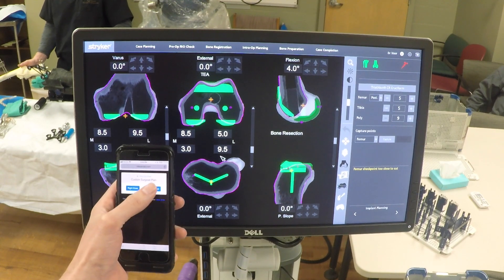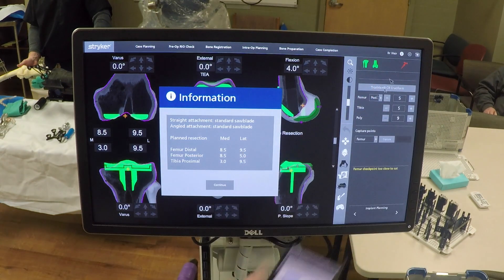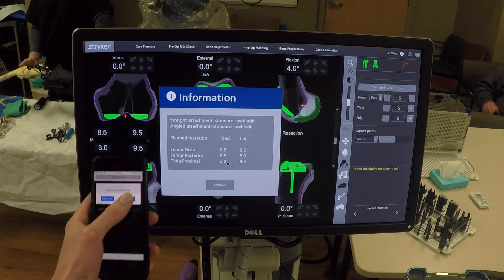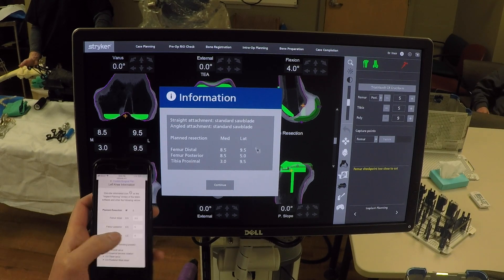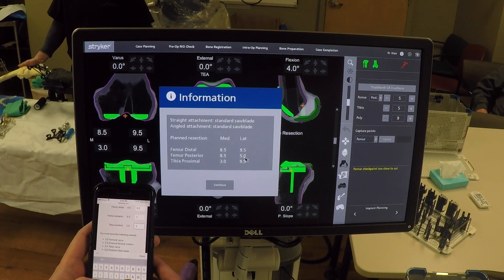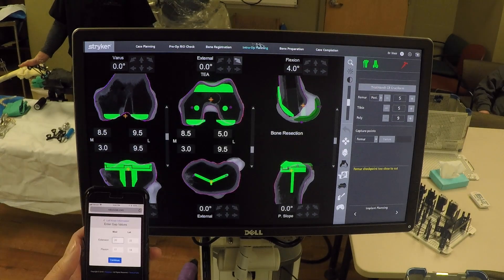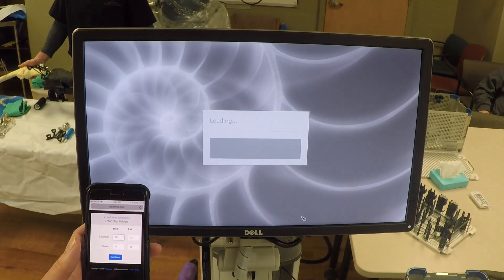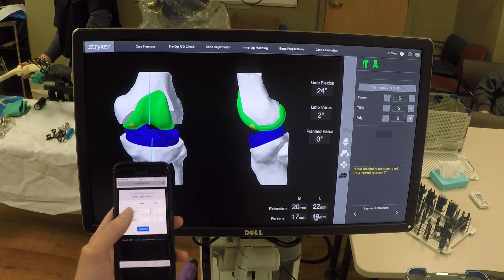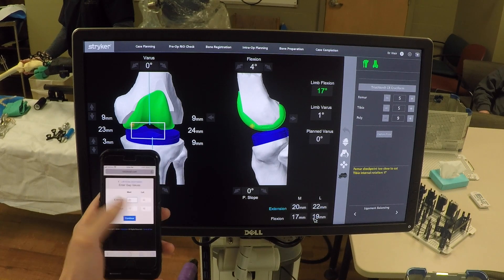The final check on the implant planning screen is to click the information button — all values should read 8.5, 8.5. We're working on a left knee here, so we click left knee and enter the lateral values in the RoboTotal app, then continue. In the ligament balancing section, we've already captured some poses; those pose values enter from the medial screen — 20 millimeters, 22 millimeters, 17 to 19 — and they are entered in.